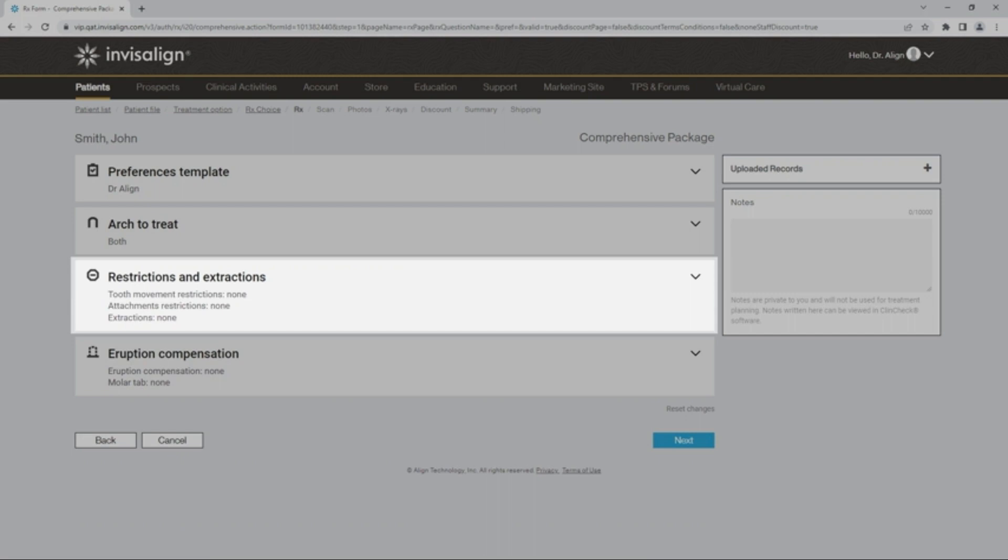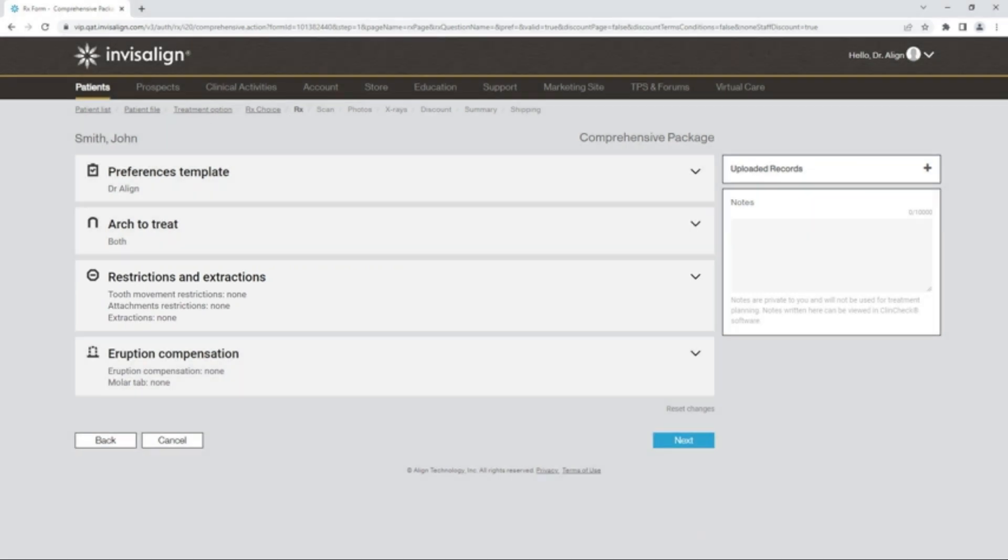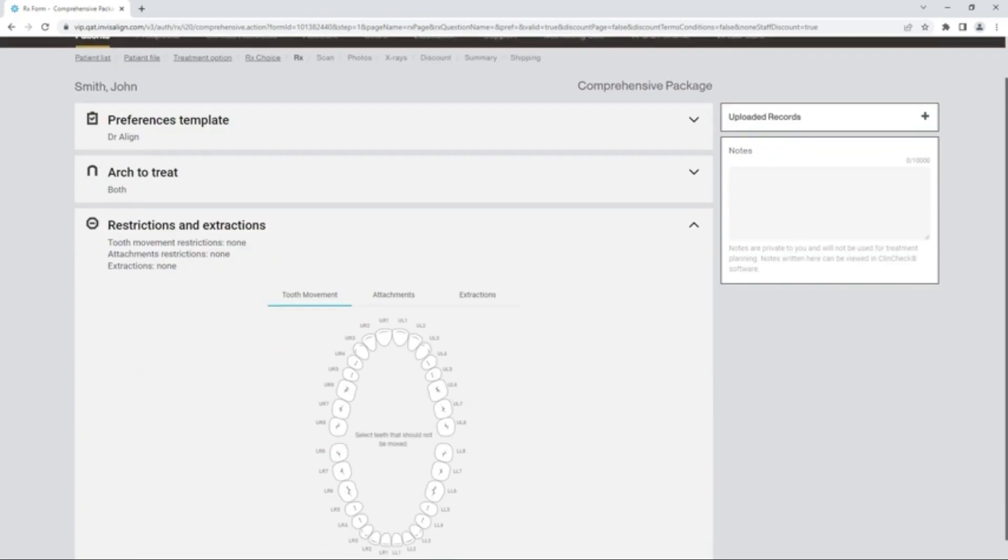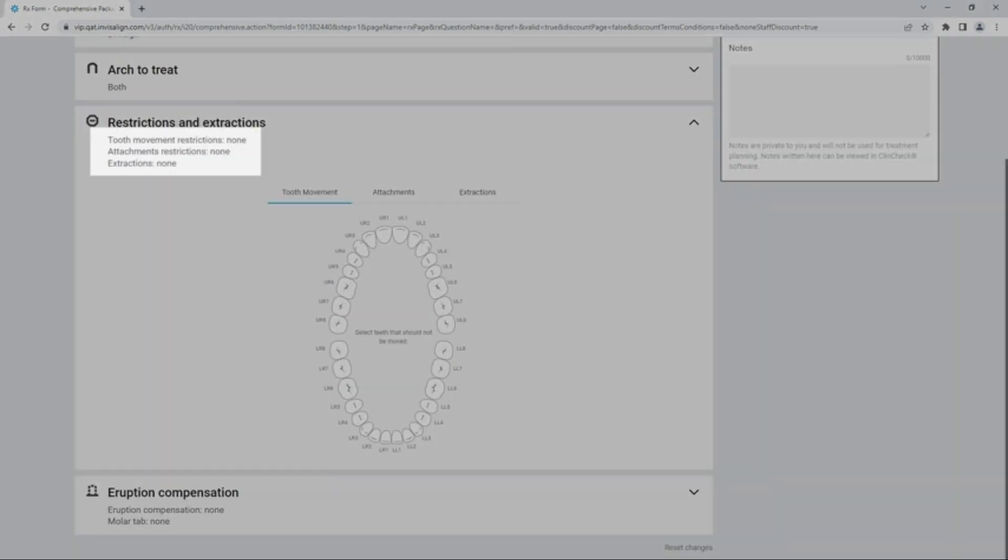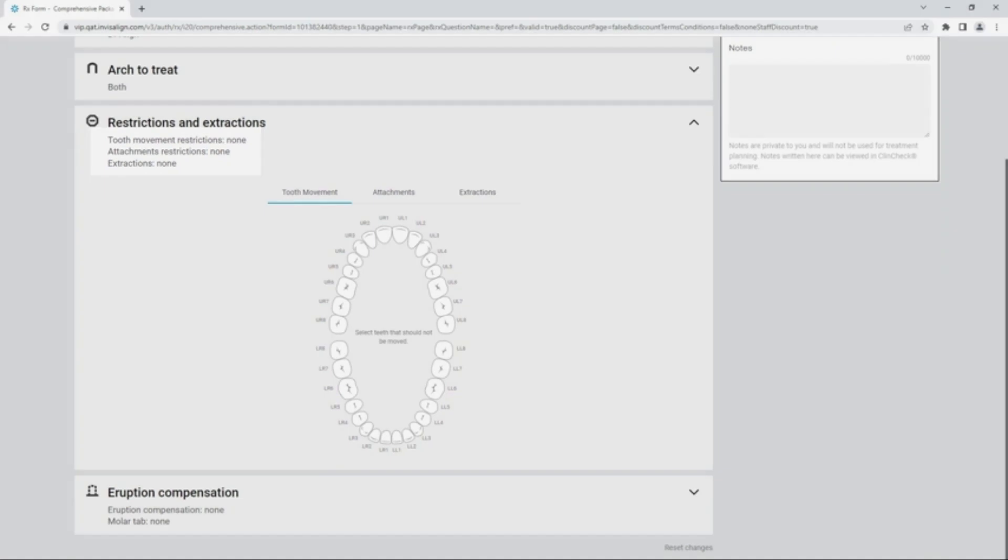The third section allows you to select restrictions on movement and attachments as well as determine extractions. As you open the section, you will notice that the default for this section is None for movement, attachments, and extractions. In this example, no movement has been selected for Upper Right 5 and Upper Left 5.